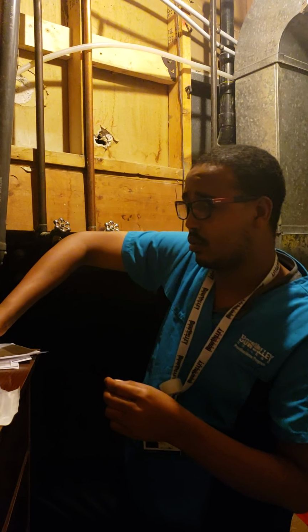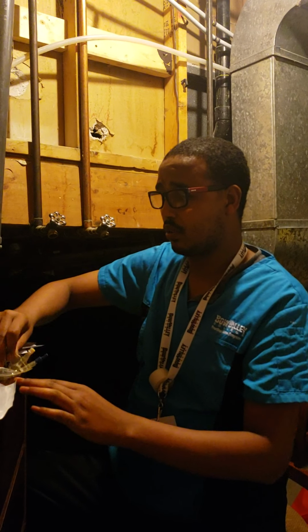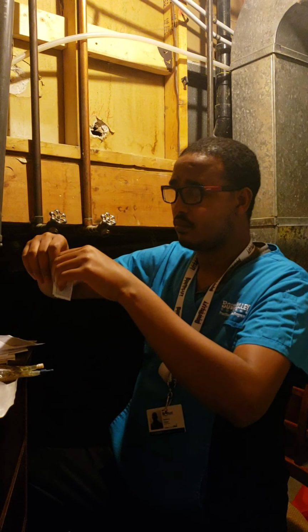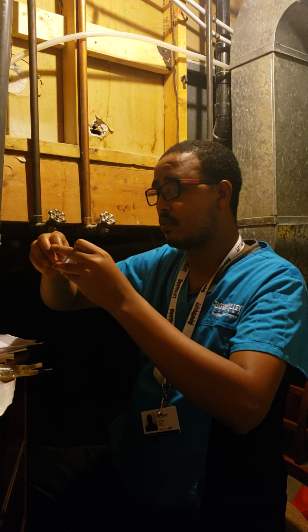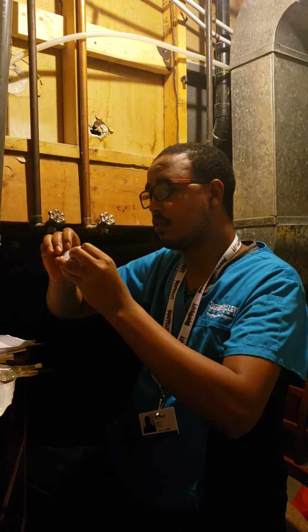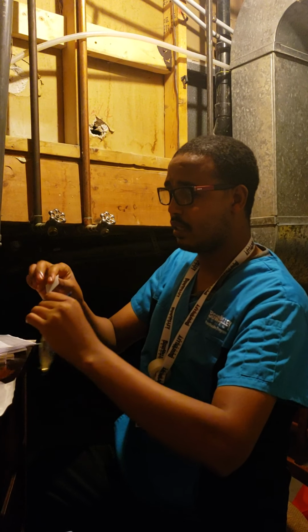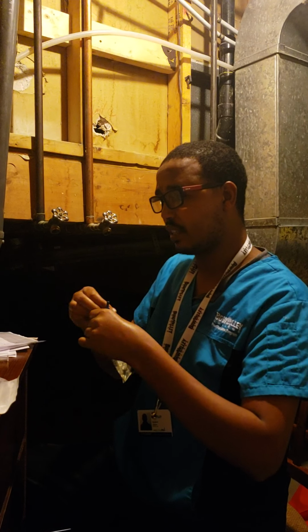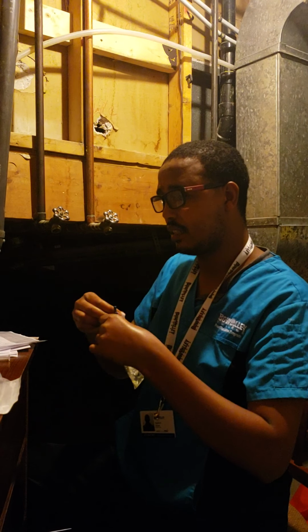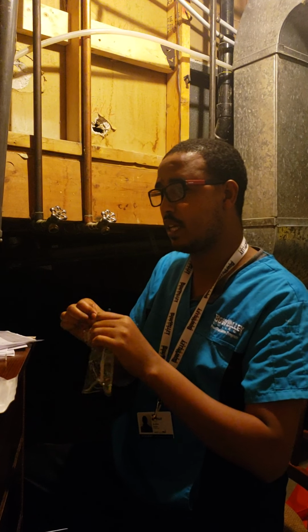Then I have to inject into my mini bag, so I have to clean my mini bag. Thirty seconds. 1, 2, 3, 4, 5, 6, 7, 8, 9, 10, 11, 12, 13, 14, 15, 16, 17, 18, 19, 20, 21, 22, 23, 24, 25, 26, 27, 28, 29, 30.